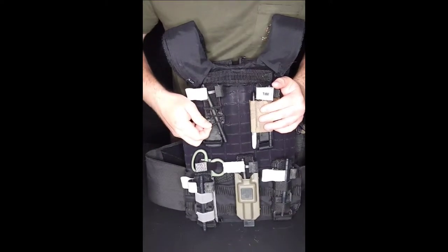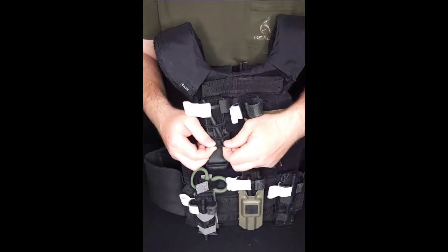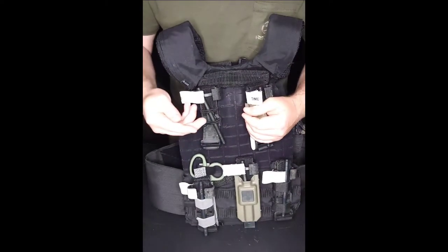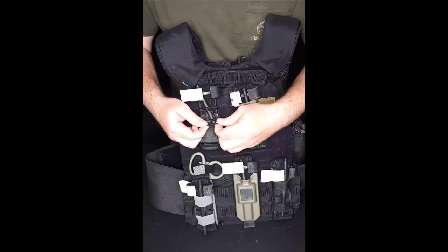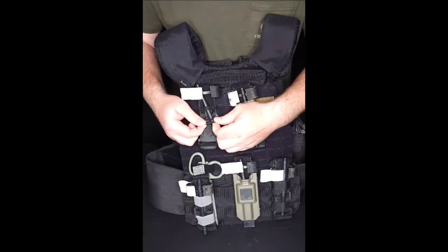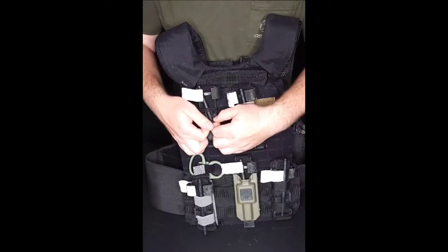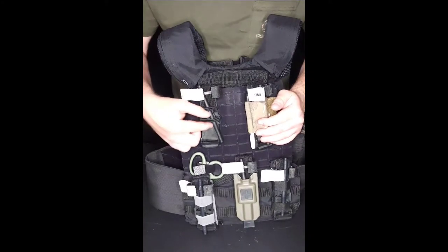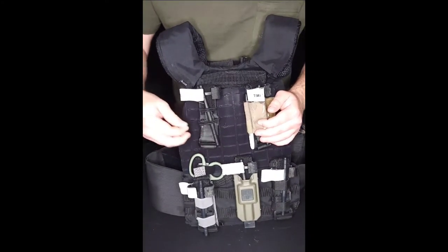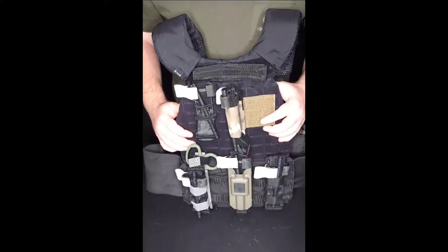Last but not least, we have some elastics — these are like hair elastics, just black ones. You can use normal elastics too, it just depends on what you have. I actually like these ones better; the rubber ones always seem to snap. If you're looking for something to hold the tourniquet securely, that does matter.